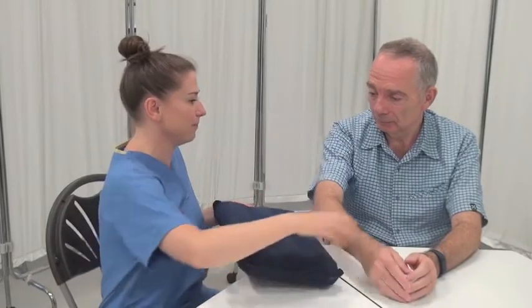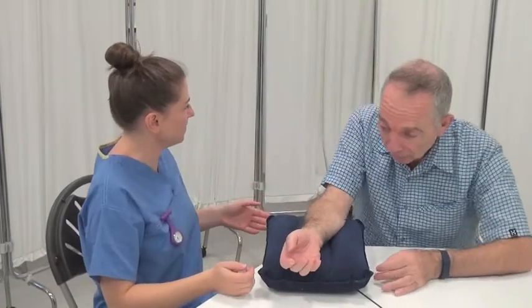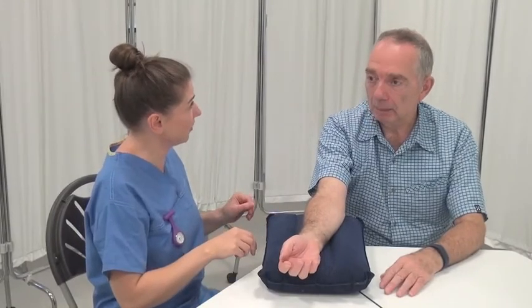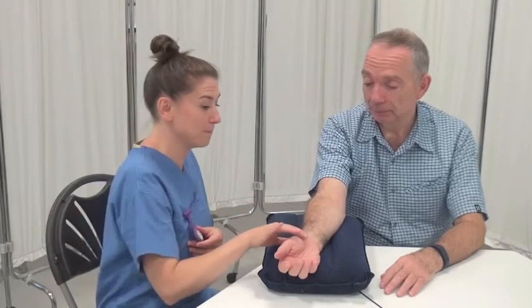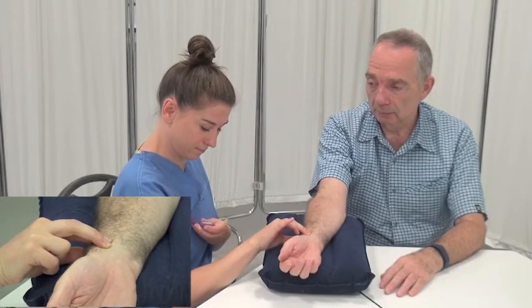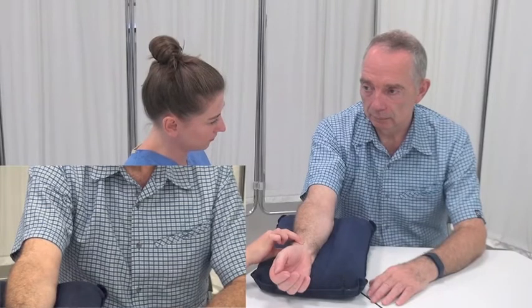Now I'm going to take the pulse measurement. Is that okay? That's fine. Would a pillow be more comfortable for you? Yes, it would, please. Okay, let's pop this under your arm then. You can just rotate it towards me. Would you need to sit up a little bit for me? Is that comfortable? That's fine, thank you. I just need to put my fingers on your wrist. Is that okay? It's going to take me a couple of minutes to do the reading. Remember, you should use the pulse observation to mask observation of the respiratory rate.